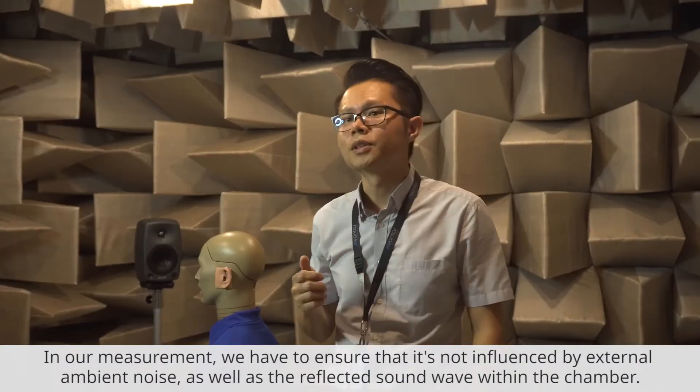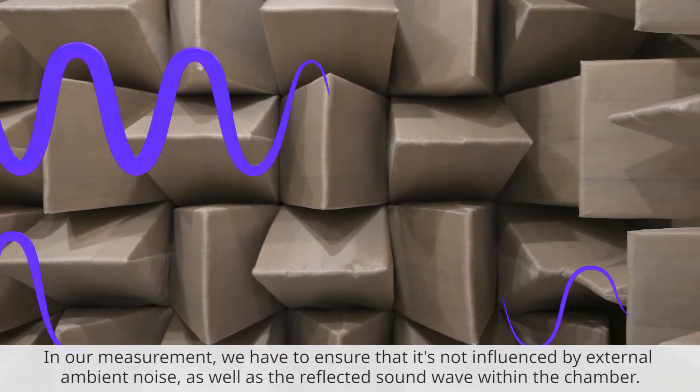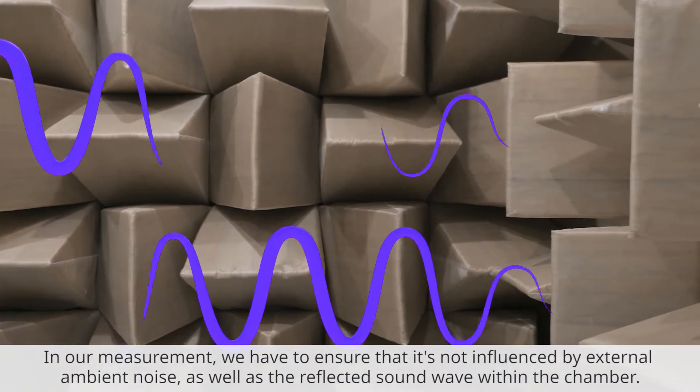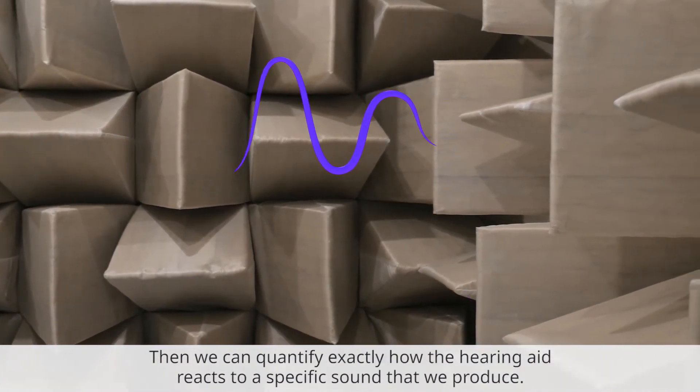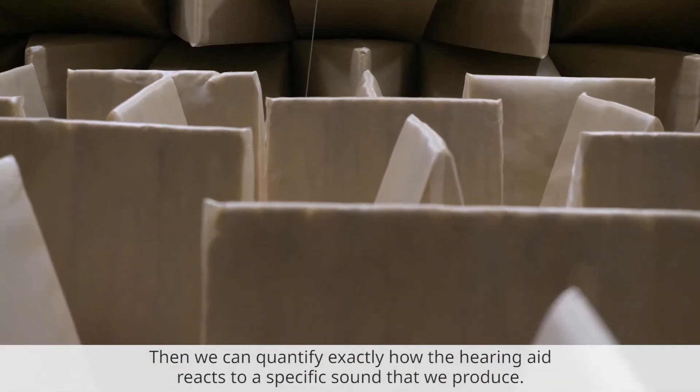In our measurement, we have to ensure that the measurement is not influenced by external ambient noise as well as reflected sound waves within the chamber itself. Then we can actually quantify exactly how the hearing aid reacts to specific sounds that we produce.